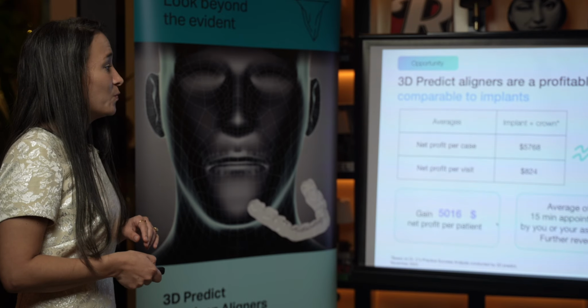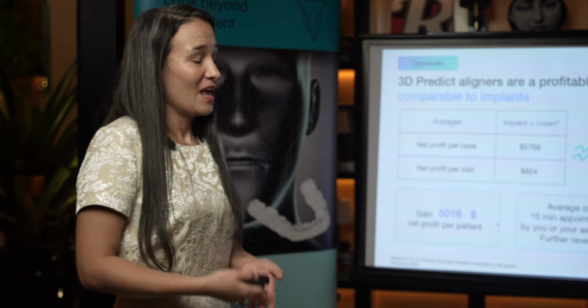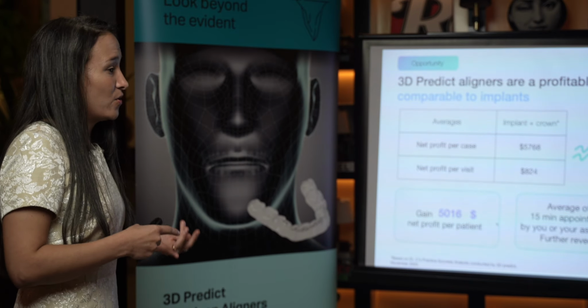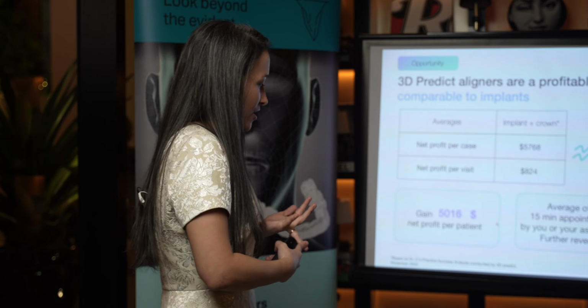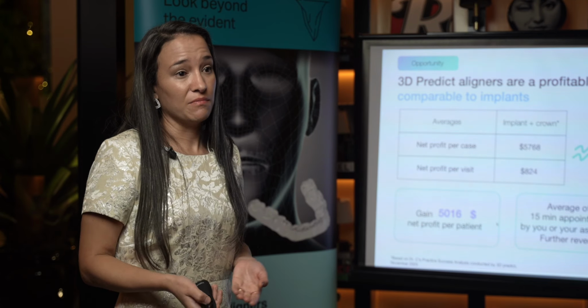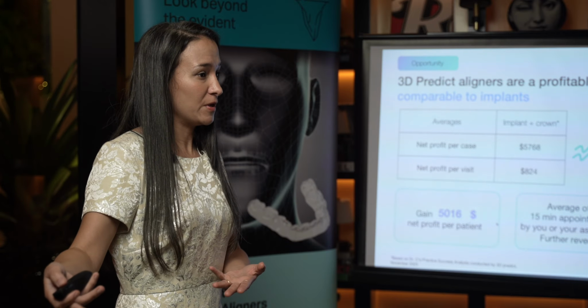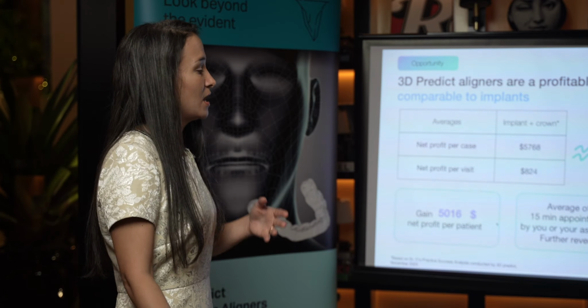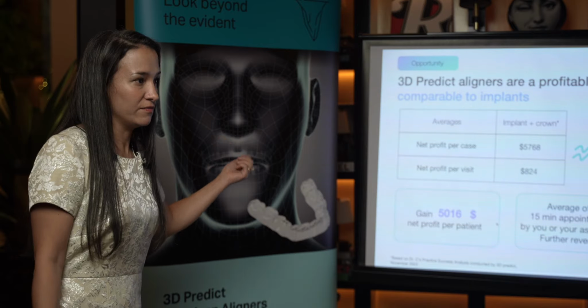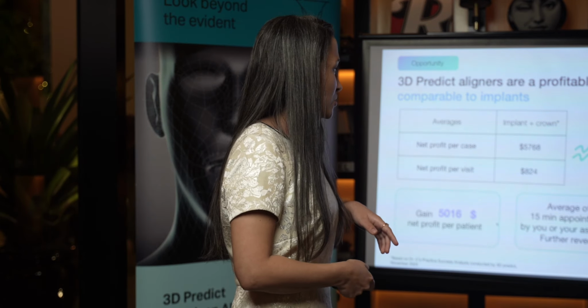And he said, but doing aligners is different. It's non-invasive. Sometimes if I don't have to do attachments, if I don't have to do IPR, I don't even have to see the patient. My assistant, because he has really well-trained staff, because he does a lot of aligner cases, just gives the patient the new sets of aligners, makes sure they fit, and the patient is on their way.